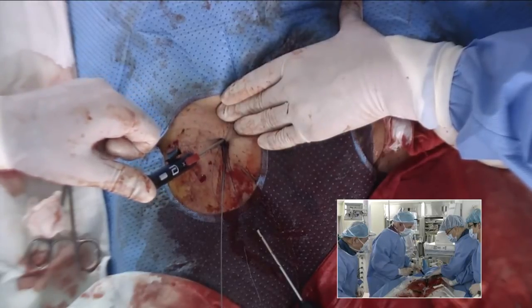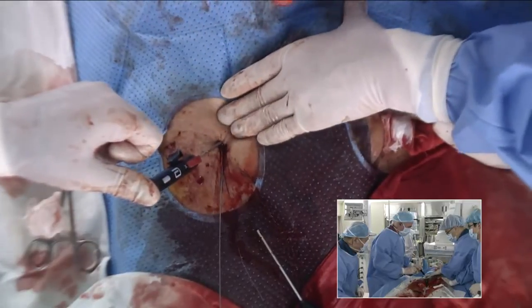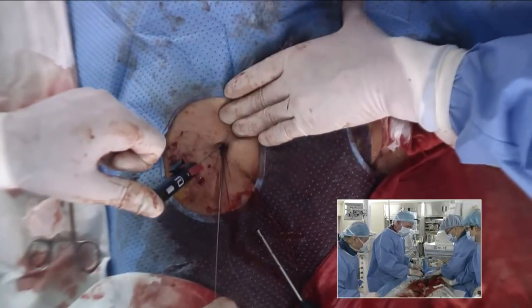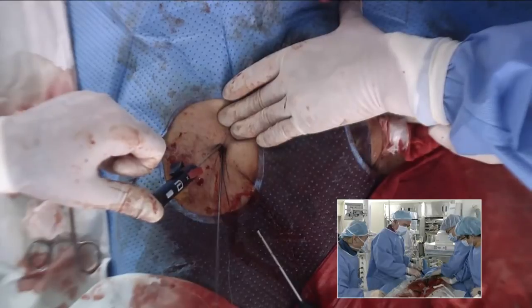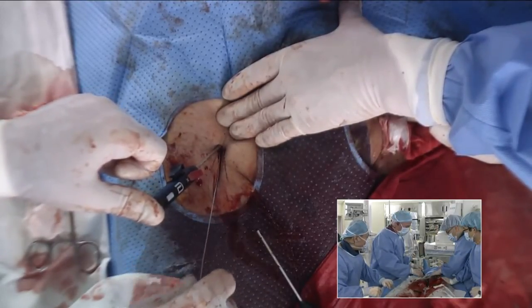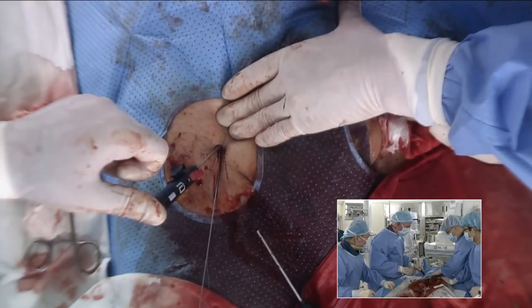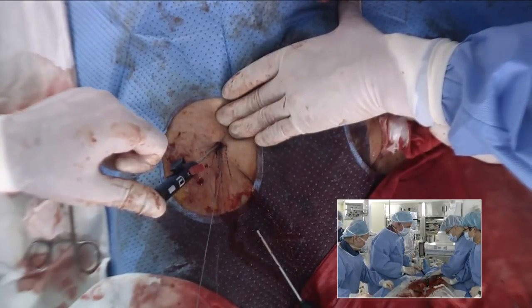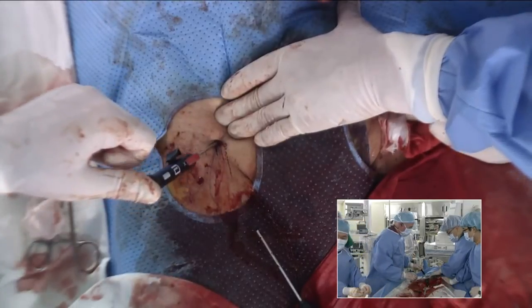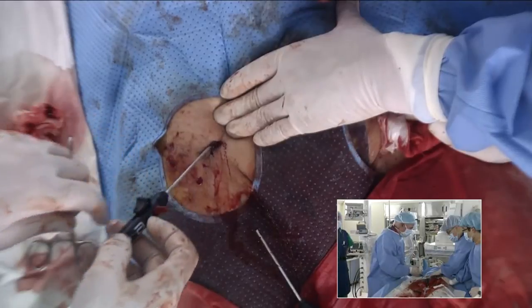Okay, you can let up a little bit, Dr. Park. Okay, I think we're in pretty good shape, actually. We've got close to hemostasis, so we're going to gently come out with a wire. This is not ideal because we have a little stiffer wire in here. I generally like to use a softer wire, so I'm coming back just very slowly with this wire. And then keeping pressure on the knot here.